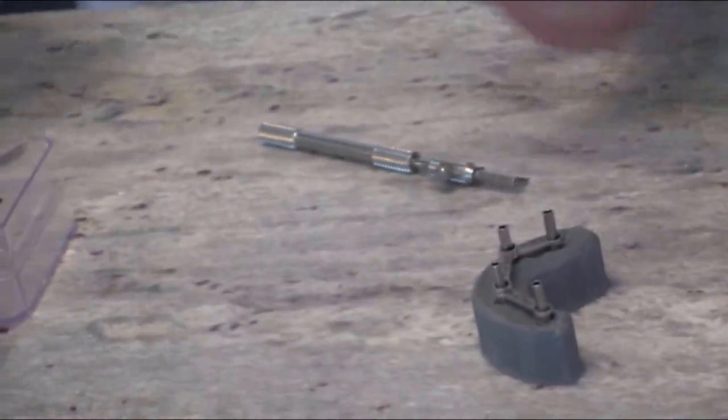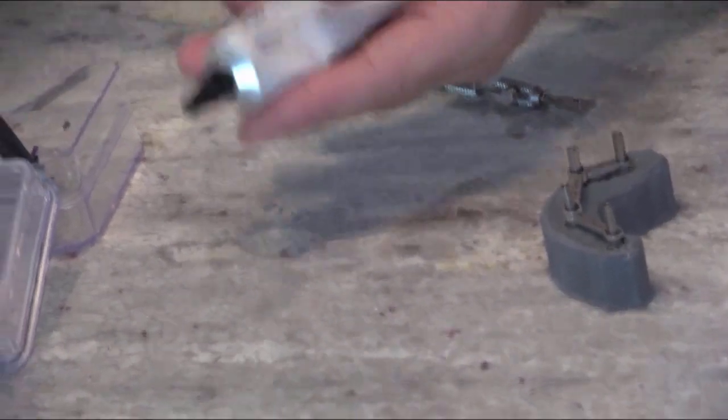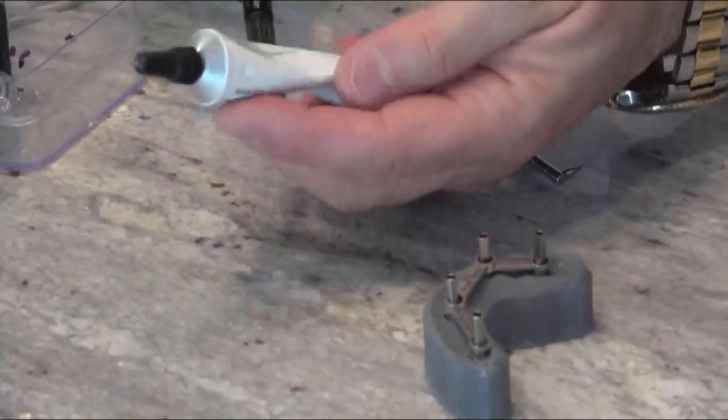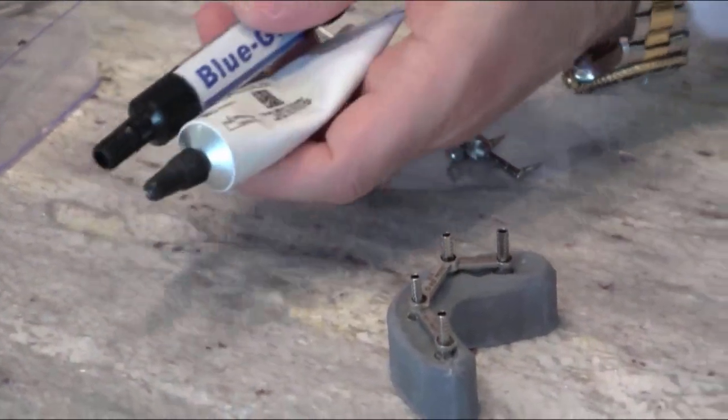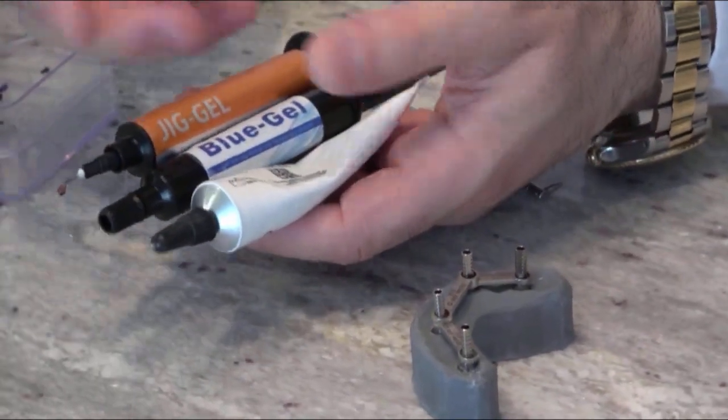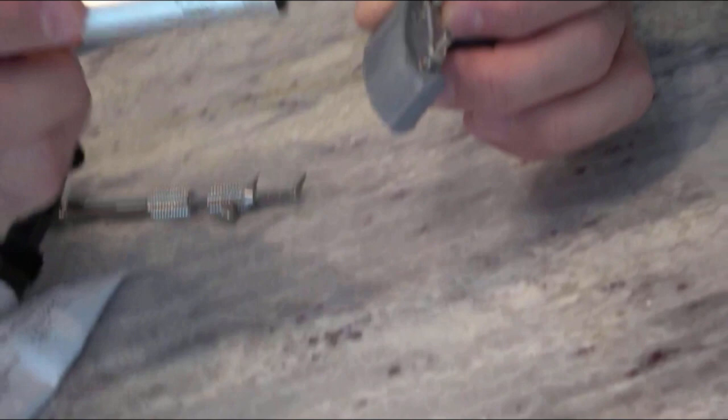There are lots of options: low shrinkage composite material, blue gel, Dentsply Triad Clear, jig gel. Lots of companies sell different materials for this.